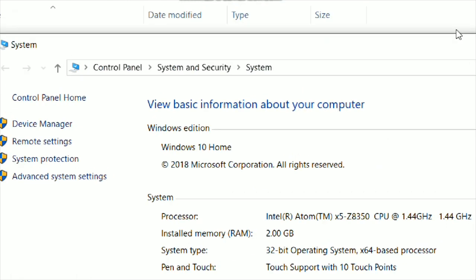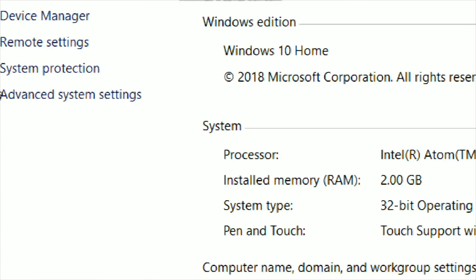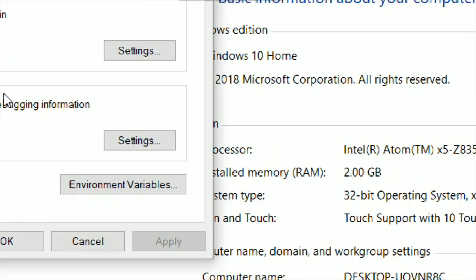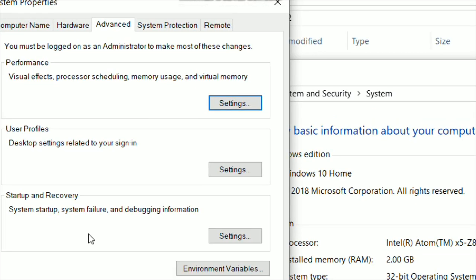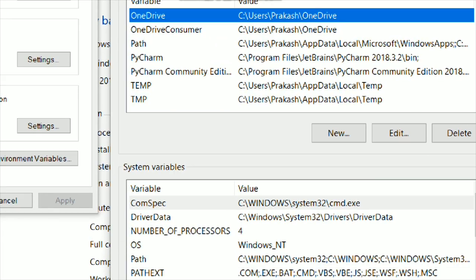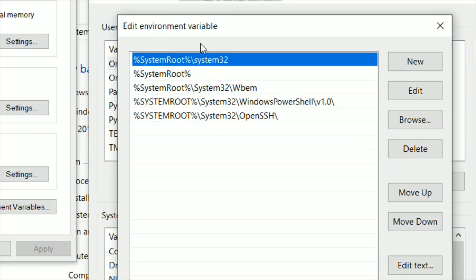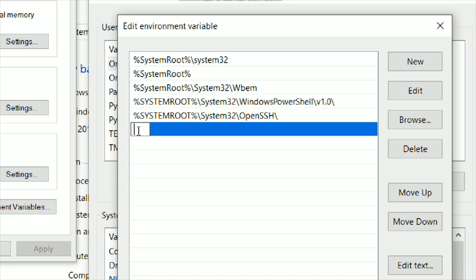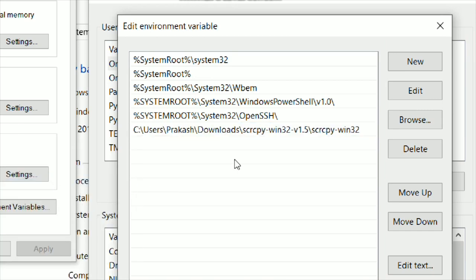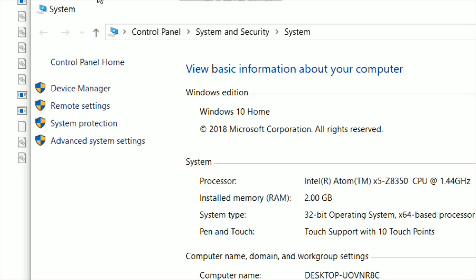Now meanwhile, I will just show you that my PC is not a very high-end one. It's basically a 2GB RAM, 32GB Windows 10 32-bit system. So at the left side, we have this advanced system settings option. Now at the right bottommost corner of this dialog box, there is this environment variables option. Here there are two sections. In the system variables section, just double click on the Path option, and at the bottom just double click in the blank space, right click and paste the location of scrcpy. Click on OK, click OK again, OK, and close this properties section.